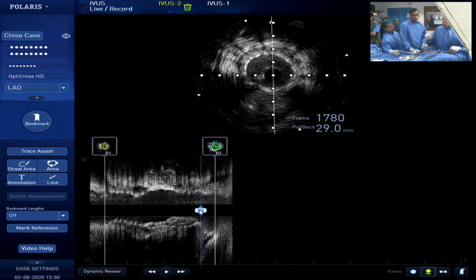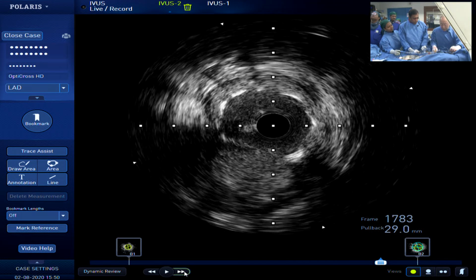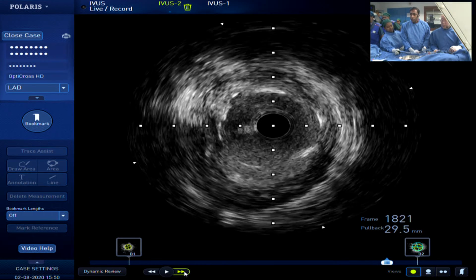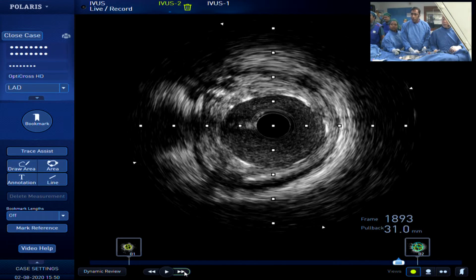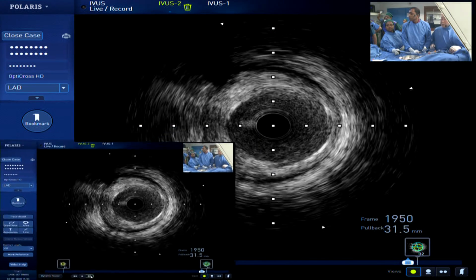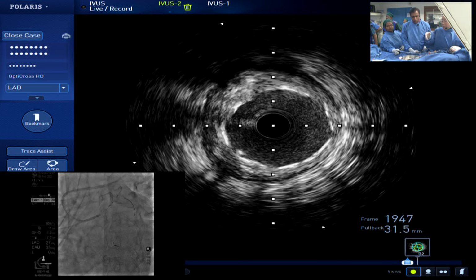So Akasaka sensei, the pinch is caused by the carina shift. Yes. So in that kind of situation, still the crossing of where the wire is crossing, proximal or distal, is a matter of issue?